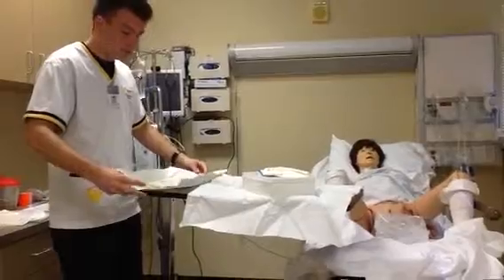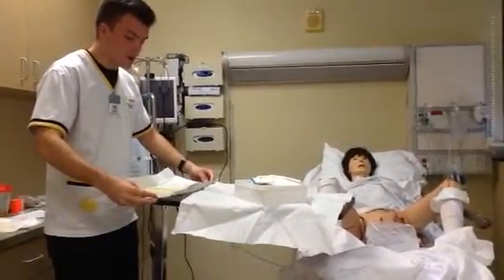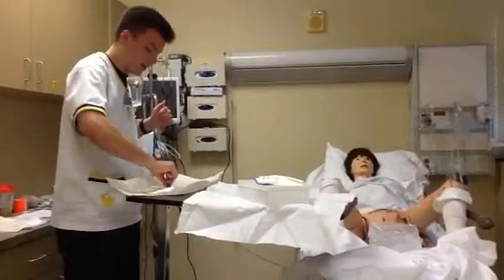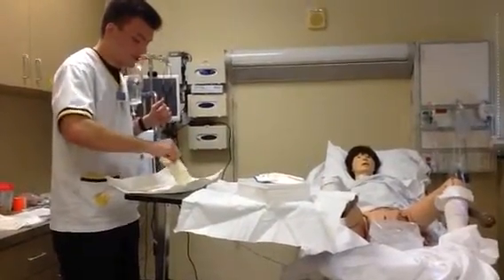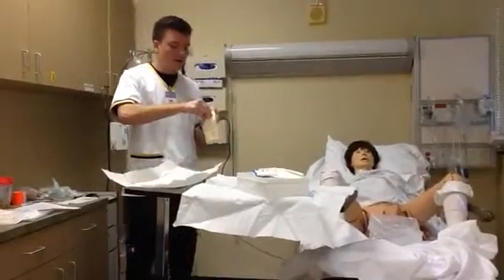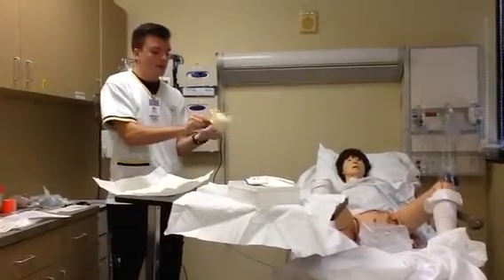Since I have opened up my sterile gloves, I'm making sure that my hands are within the 1-inch borders at all times, and that it does not drape over my catheter field. I'm going to pick up my dominant hand first, which is my left hand. Take a step back, making sure to only touch the cuff of the glove.